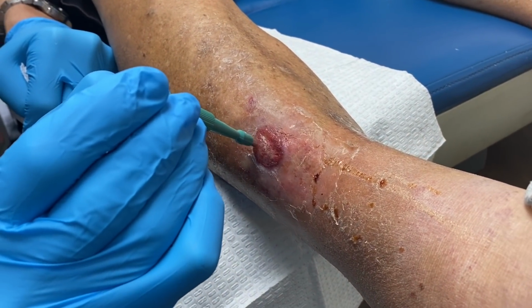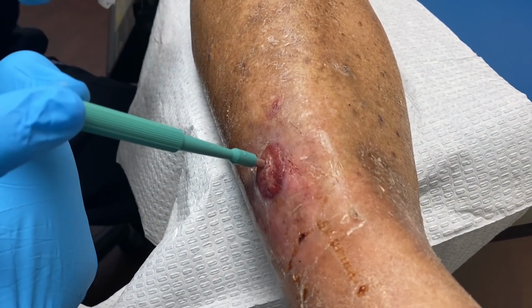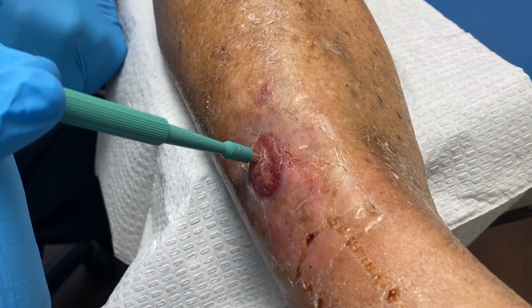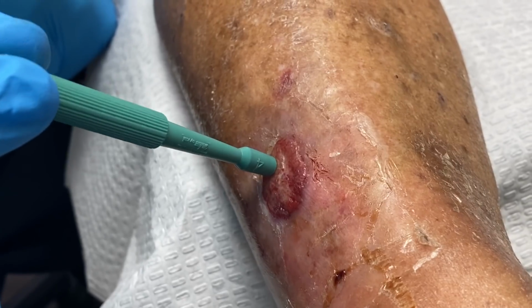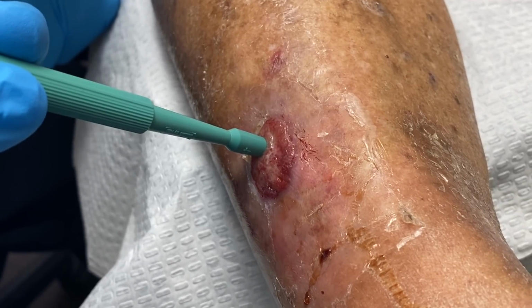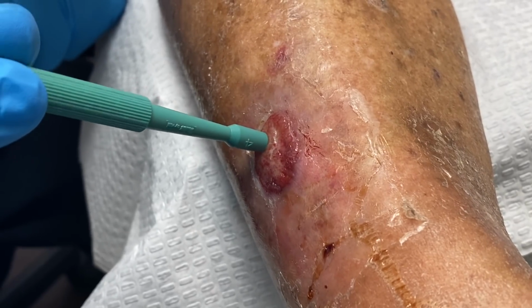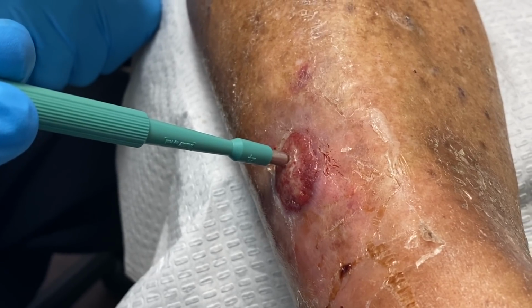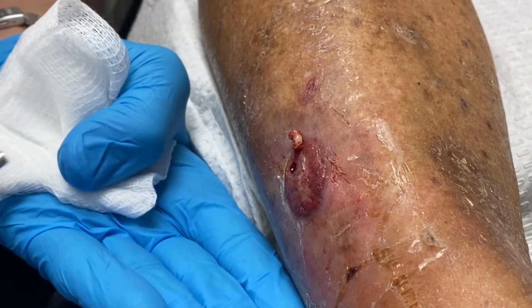So again, the trick is, patient, if you feel anything, just please let me know, right? I like to use, again, the 2-finger technique. And these biopsy instruments are sharper than anything that you guys can possibly imagine. We go all the way down. I like to press down a couple times like this. Okay. And then slowly wiggle it out. Right? And the reason why I like to do that, whoa, there it is, right?